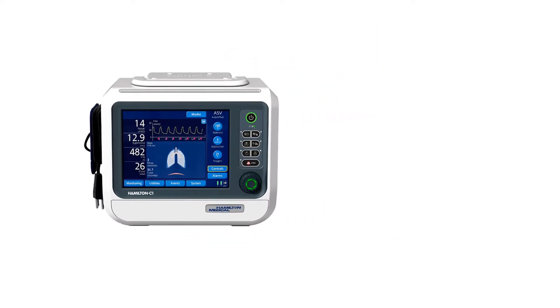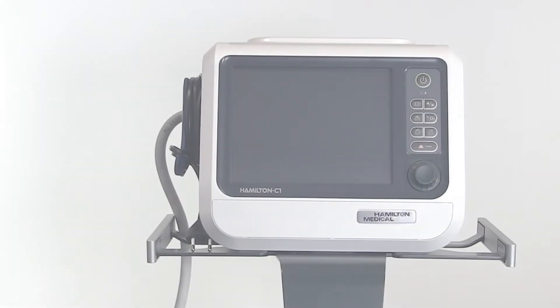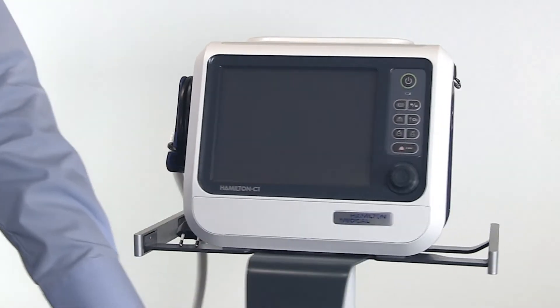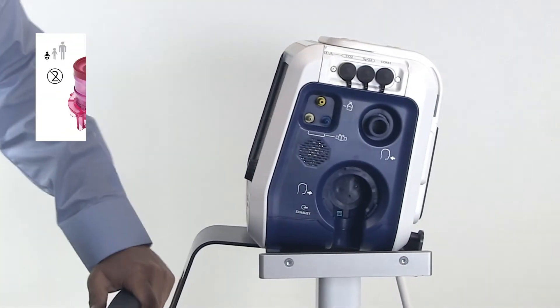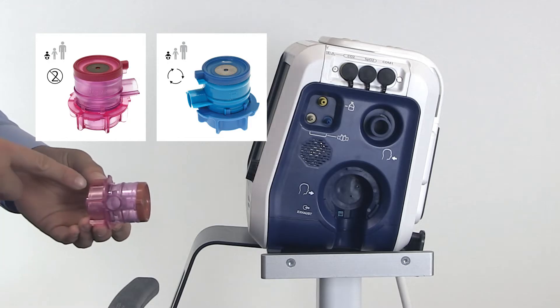We'll use the example of the Hamilton C1 to show you how to set up the ventilator, how to initiate neonatal ventilation, and how to adjust the neonatal ventilation modes. It works the same way on the Hamilton T1 and Hamilton MR1. Make sure you are using a dedicated neonatal expiratory valve, which has the same membrane as the other valves but a smaller internal diameter.